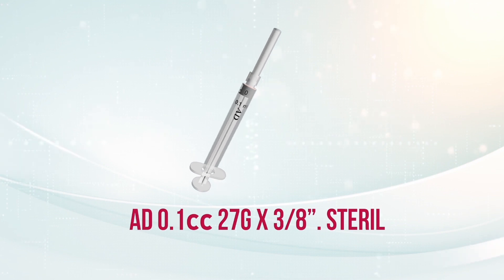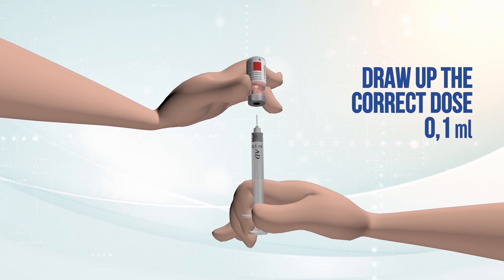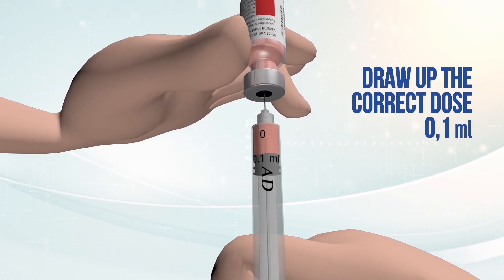Take the vaccine out of the thermos and verify that it is the correct vaccine, its expiration date, and its open date. Draw up the correct dose. Return the vaccine vial to the thermos and close it immediately.